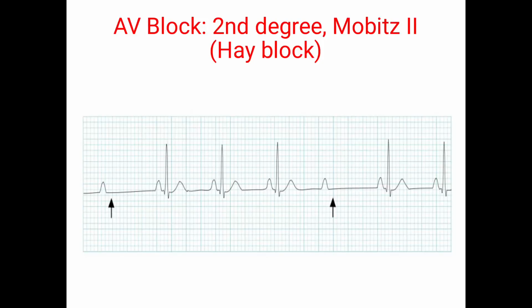Friends, in this topic of basic ECG, today I will talk about second degree Mobitz type 2 heart block. It is also called Hay block.